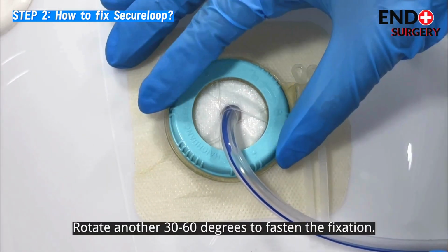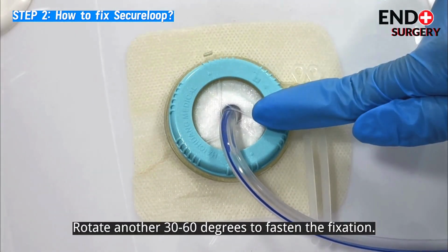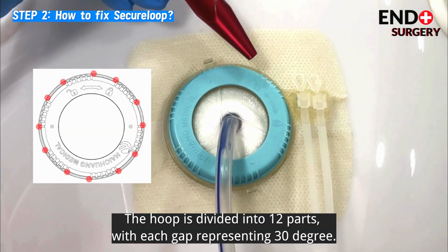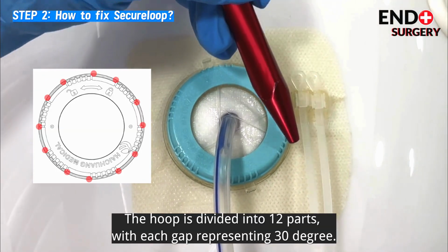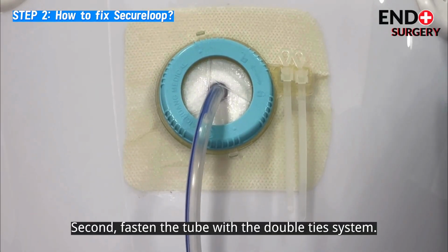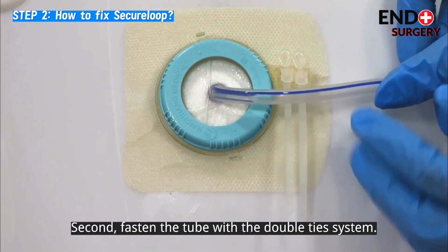Rotate another 30 to 60 degrees to fasten the fixation. The hoop is divided into 12 parts, with each gap representing 30 degrees. Second, fasten the tube with the double ties system.